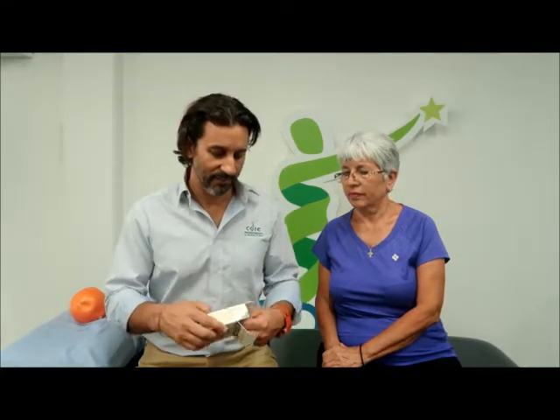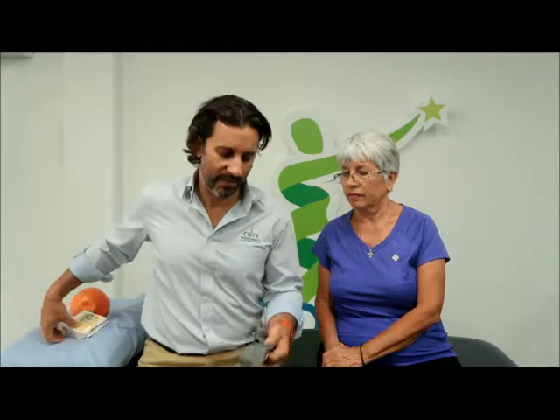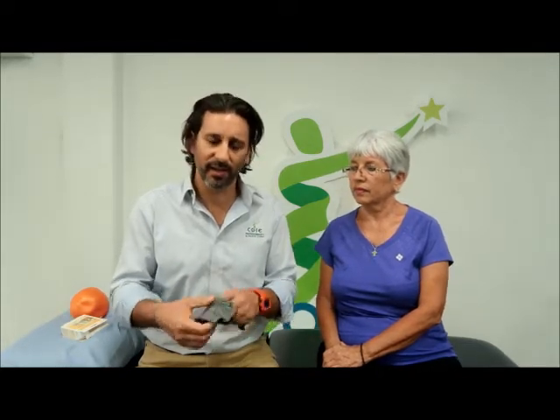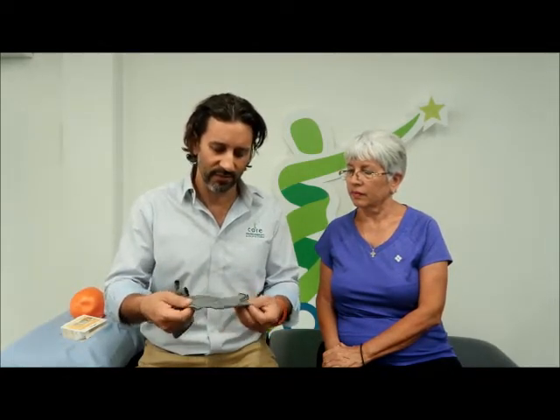They're asking because it works great. So let's take a look at what's in the box. It comes with two gloves — they're a fingerless glove, quite a dark grey colour, and a very compressive cotton elastane glove. To have a little look at some of the features, we'll get Helen to start by putting one on.